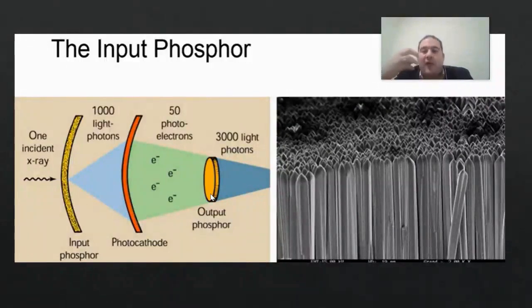Consequently, the number of electrons emitted from the photocathode has also decreased. This means that the light photons coming from the phosphor have decreased. Therefore, if the diameter decreases, or if your field of view decreases, you have effectively reduced the brightness that will occur.